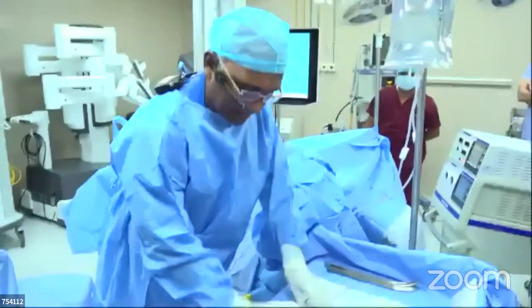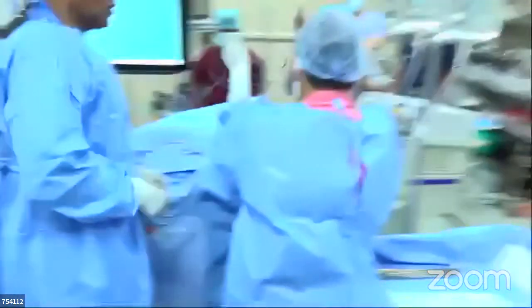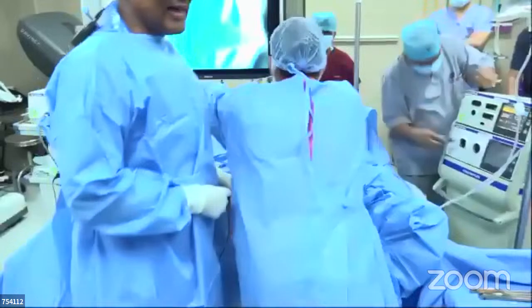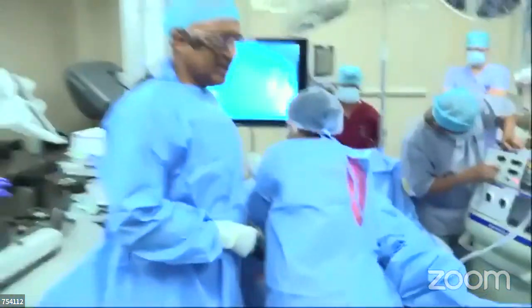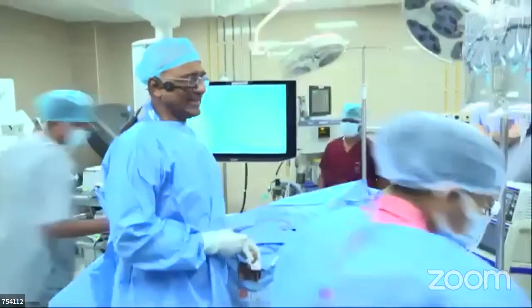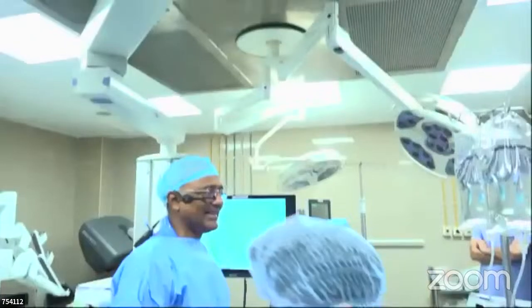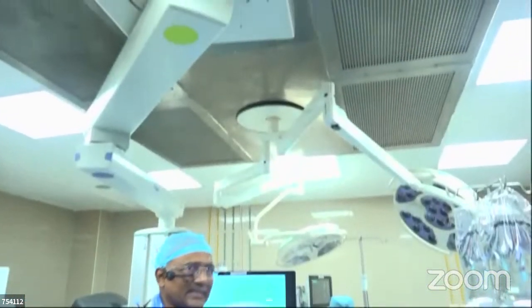procedure. But Mali, why do you want to use a 24 only? Why don't you use a 26 itself? I really don't want to use it in a smaller gland. I don't think a continuous flow resectoscope with a 26 size is of any use. Basically, I think a 24 with intermittent emptying of the bladder is good enough in these patients.